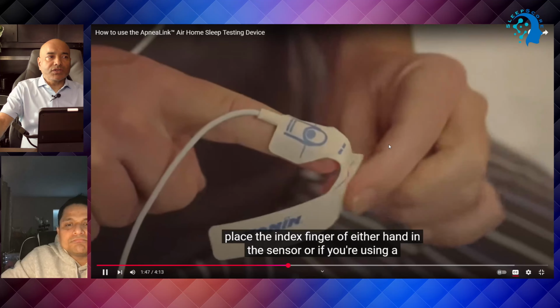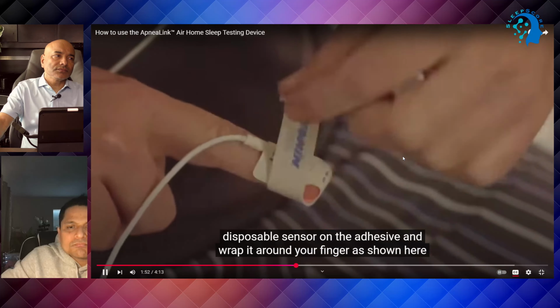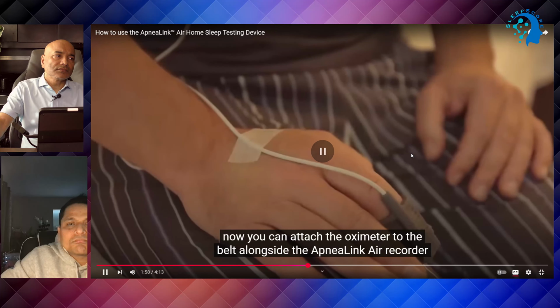And this is reusable, or if you're using a disposable sensor, this is the disposable adhesive. Wrap it around your finger, as shown here. Secure the line using the tape supplied. So in that way you put the tape over there so that it will not come off easily.